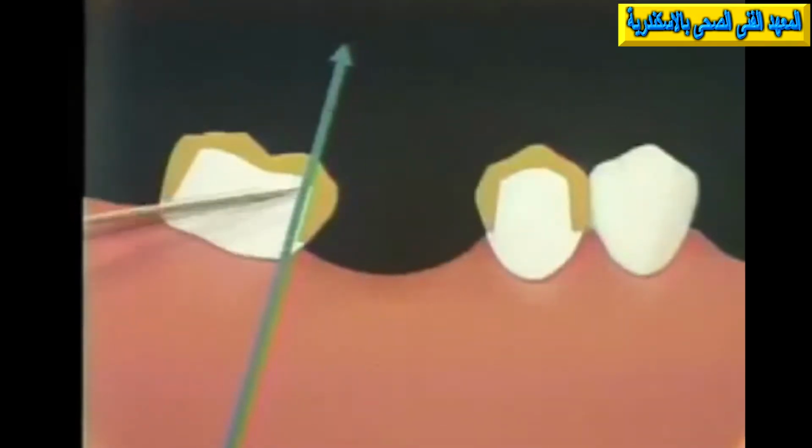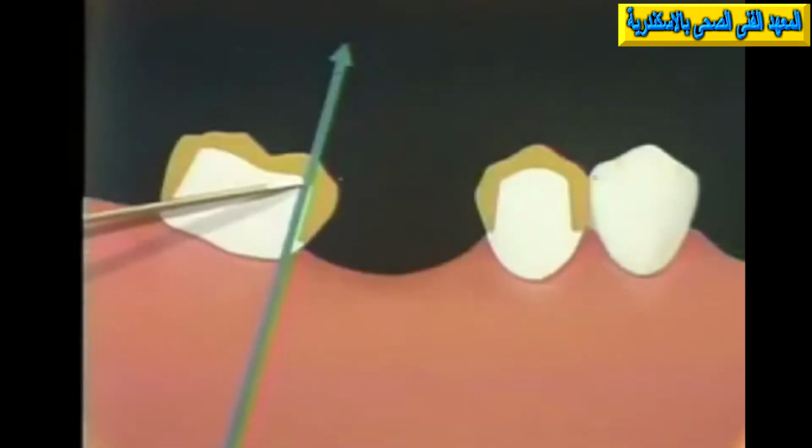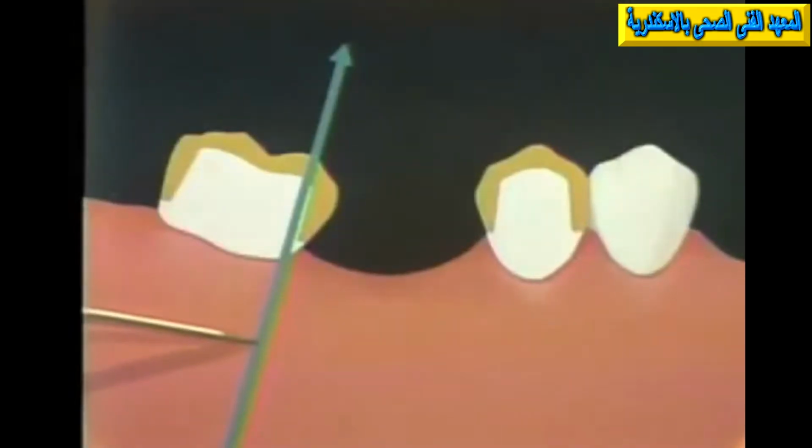This is about as far distally inclined as it's possible to make this mesial wall in this particular clinical case, so that the line of draw of this preparation is dictated by that mesial wall and represented here by this arrow.